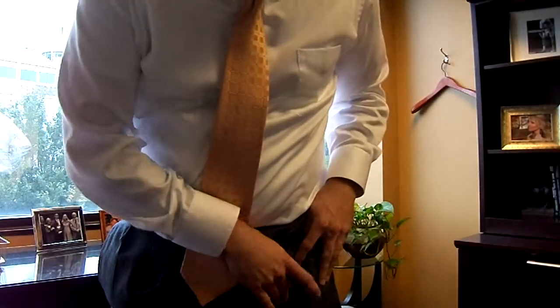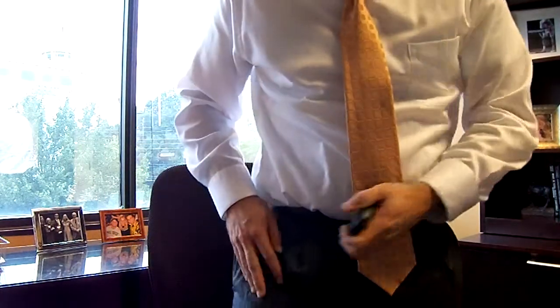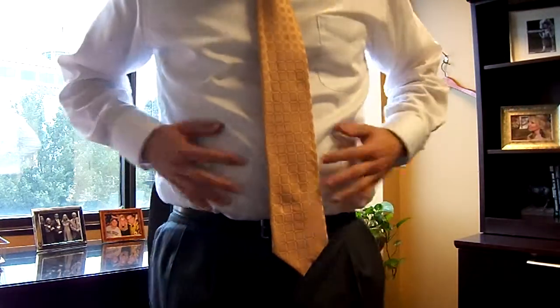But all in all, they've made pretty steady progress with their devices. I have read that they're actually working on making these pods a lower profile, so that way it doesn't stick so high up, which is going to make the biggest difference for when I wear it on my arm. Right now, my pod is on my upper thigh, so I'll wear the pod right up here, and then I have my Dexcom 7 Plus device on my other upper thigh, and I will rotate it between my thighs, both sides of my stomach, and both of my arms.